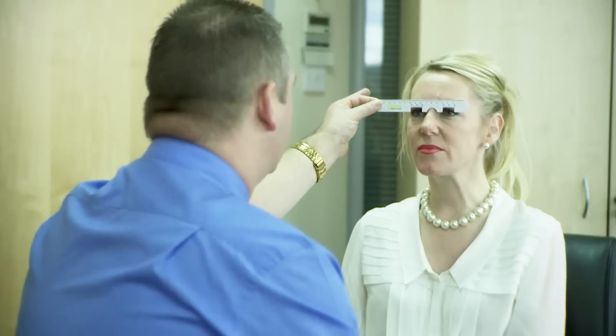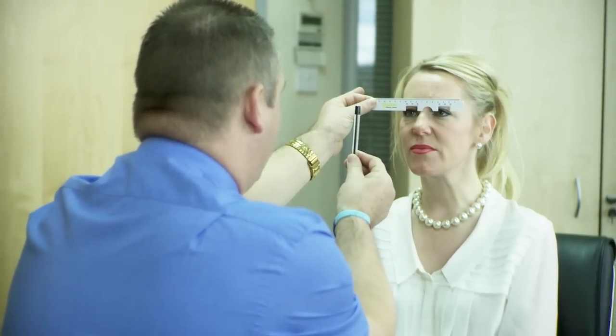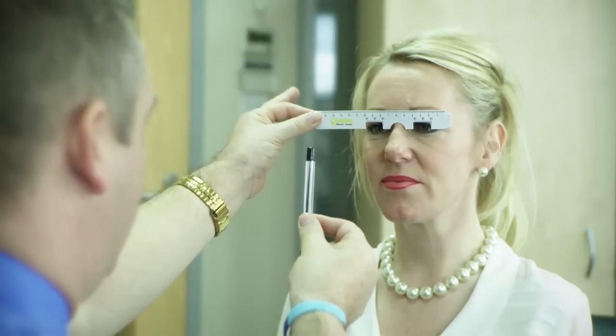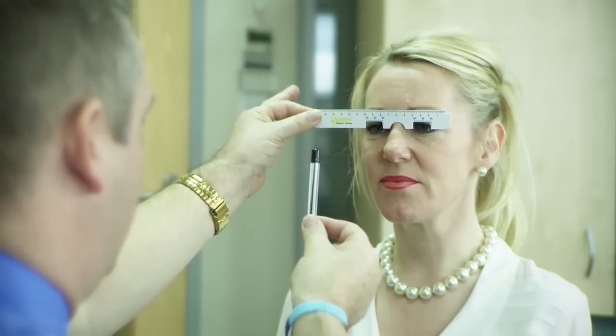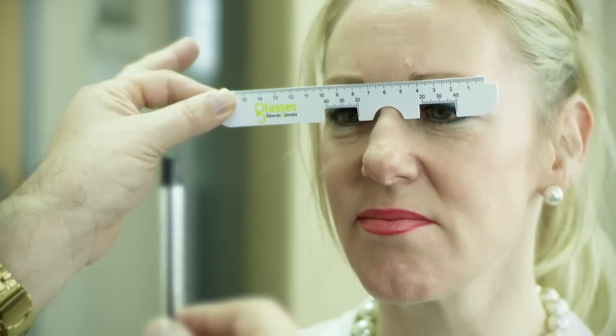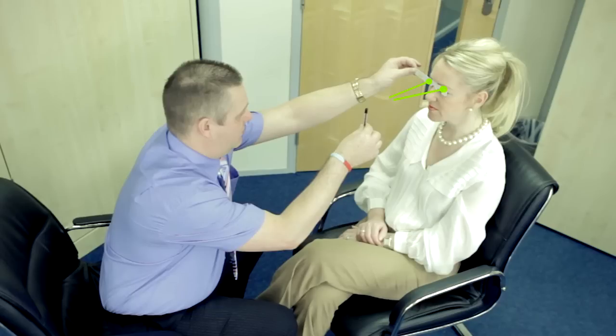The only difference is that people being measured should focus on an object closer to their face. Hold a pen around 30cm in front of your face and keep your focus here while your PD is being measured. This will cause your eyes to converge slightly, giving you a more accurate reading PD measurement.